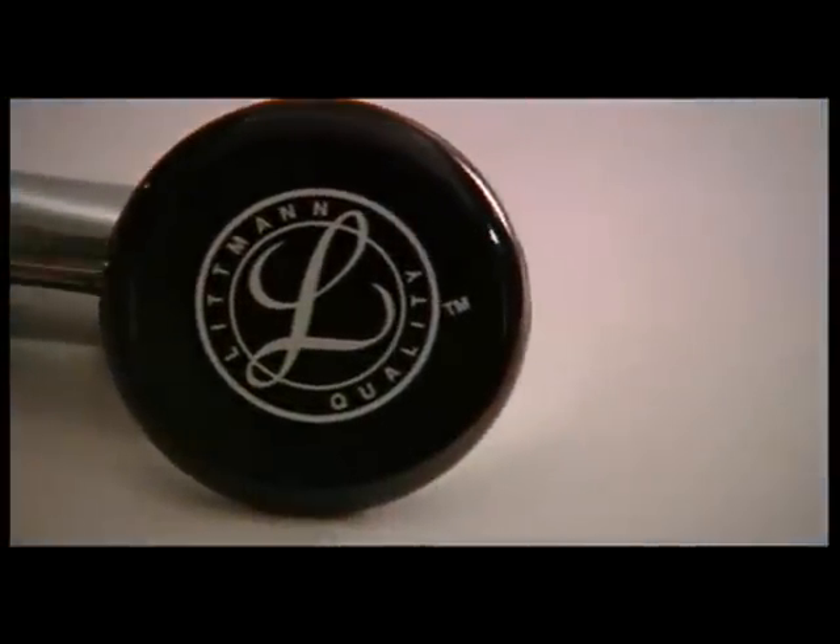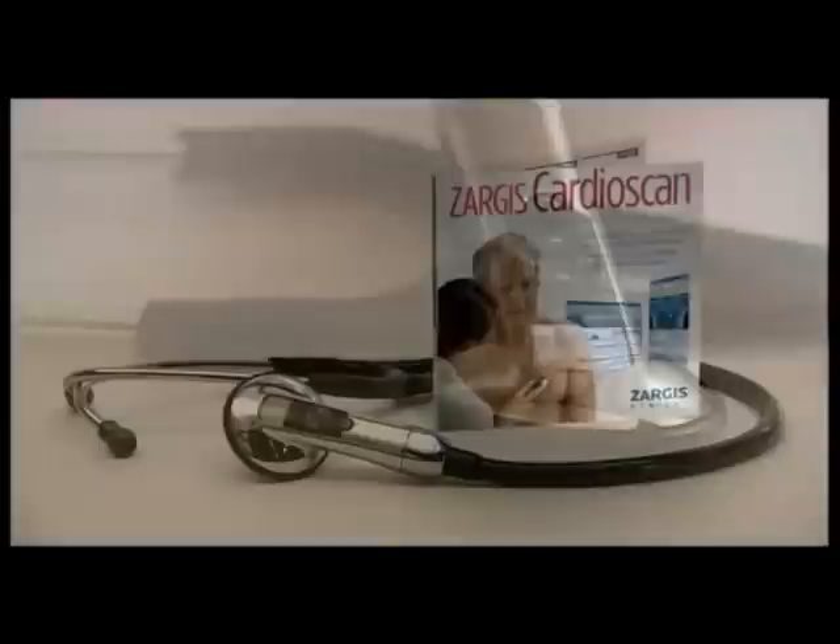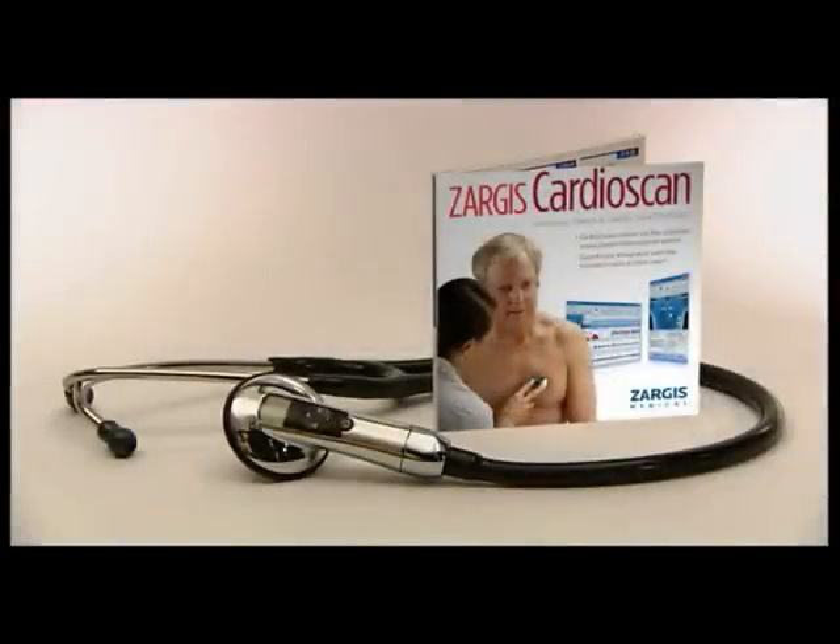The 3M Littmann Model 3200 electronic stethoscope combined with Zargis CardioScan heart murmur detection software are transforming the way clinicians will use auscultation for the benefit of their patients.